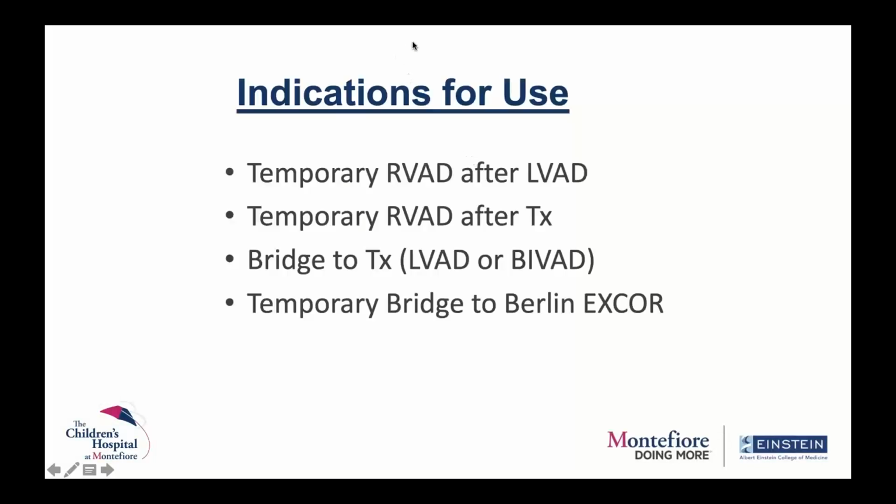So what are the main indications for using a Centromag? If you have some sort of an LVAD, and now remember I talked about right side of the heart failing, or an RVAD. Sometimes these patients need temporary support of the right side, and you can sometimes need temporary support even after a transplant. So if you need temporary right side support, you can put in an RVAD as a Centromag.